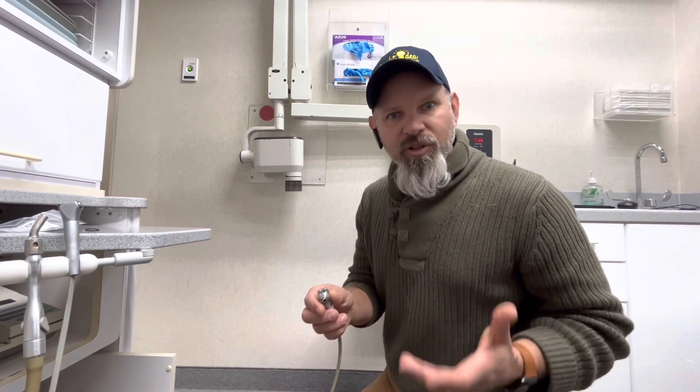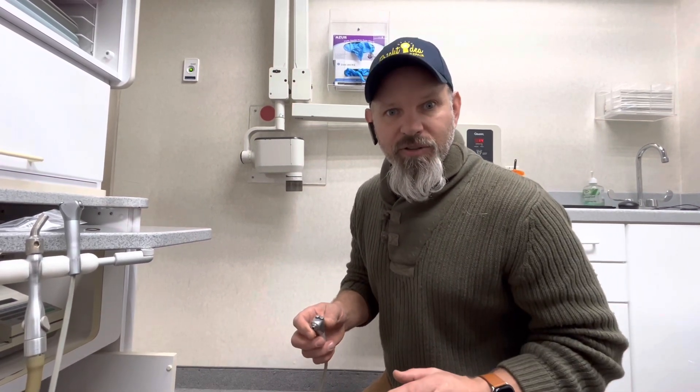Hey guys, it's Jason from the Dental Clean Repair Channel. Today I've got a client that has a water pressure issue, and I just want to show you the way that I troubleshot it super quick to find out where the issue was.